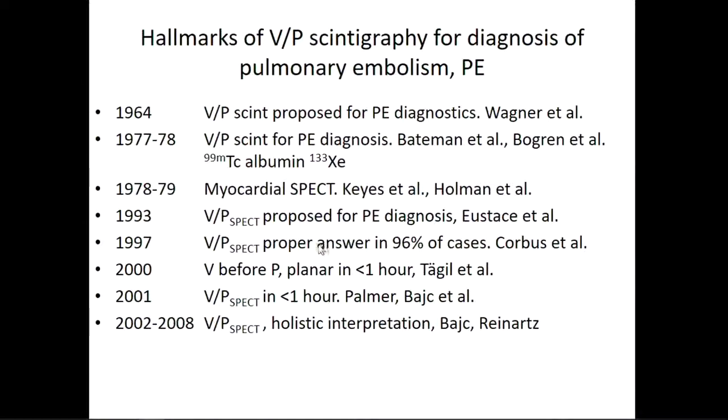In those days, one still performed perfusion scintigraphy first, and then after a few hours or the next day the ventilation scan. But we developed a technique presented in the year 2000, where we showed that you could do ventilation before perfusion, and the whole procedure could be finished from referral to report in 1 hour.